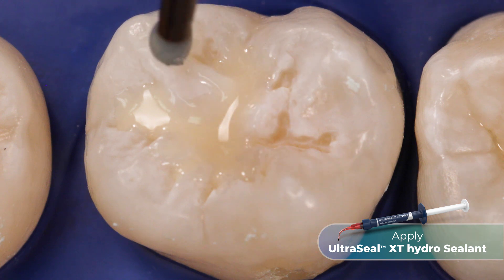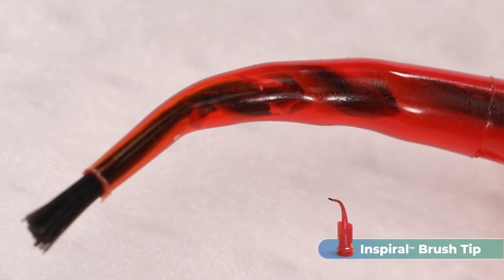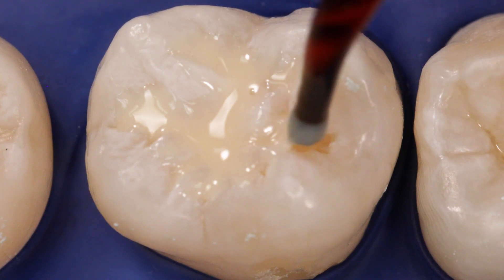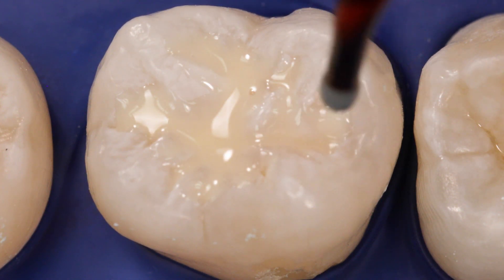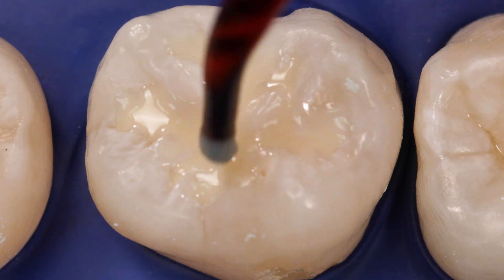Work the resin down into the grooves with the brush tip. The spiral brush action of the Inspiral brush tip causes shear thinning of the thixotropic UltraSeal XT Hydro Sealant. The resin stops flowing when the shear thinning ceases and placement is complete, preventing it from running before it can be light cured.